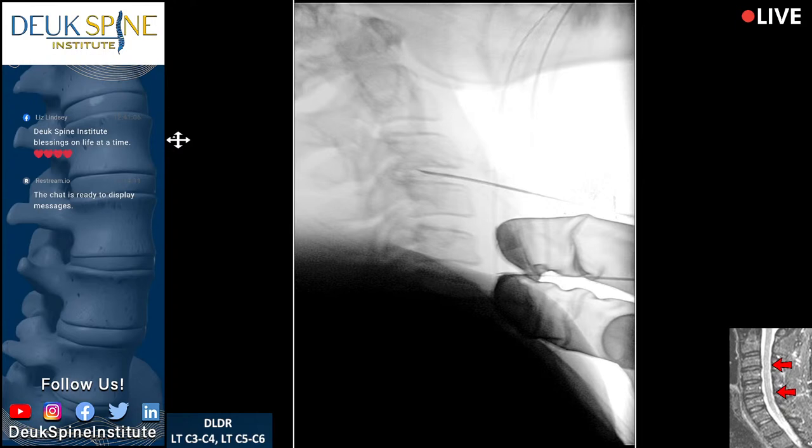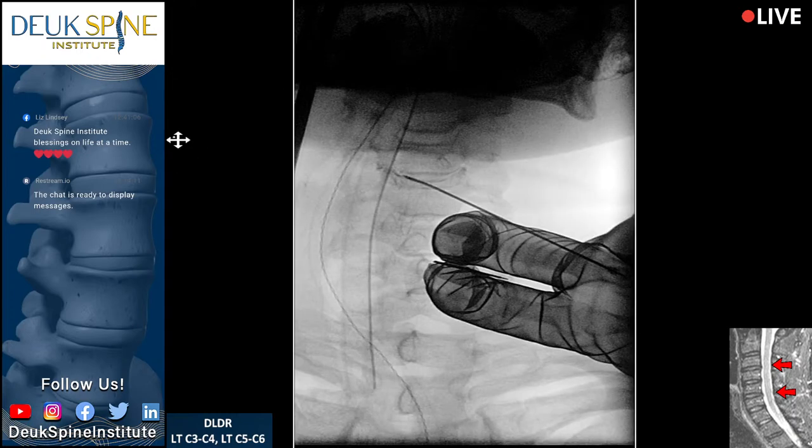Let's get an AP view. The good news is he's got a nice, thin neck and you can feel the spine. We're in the middle.